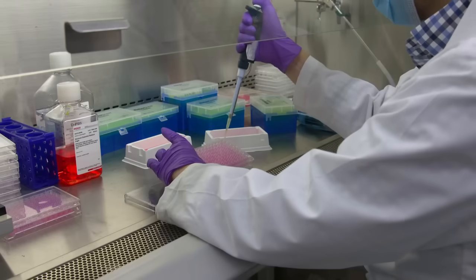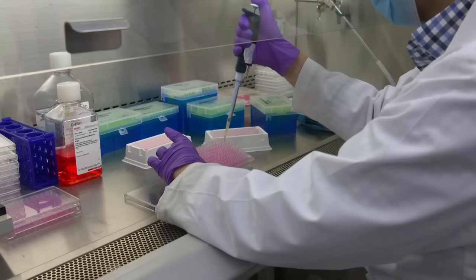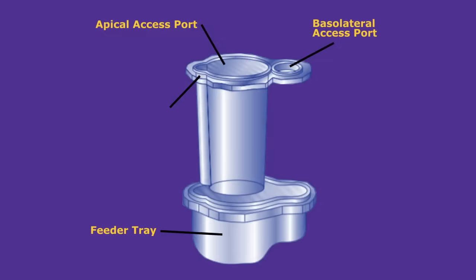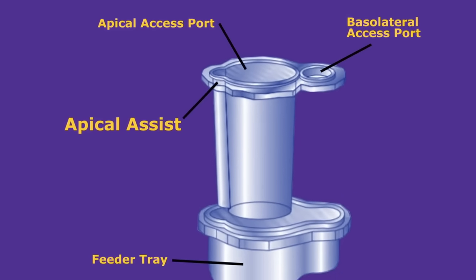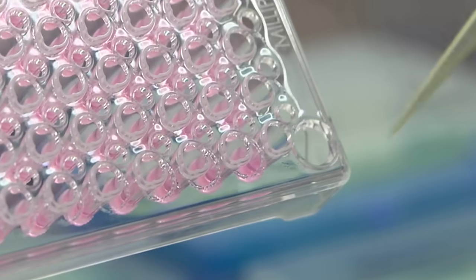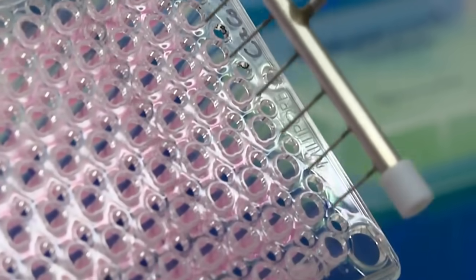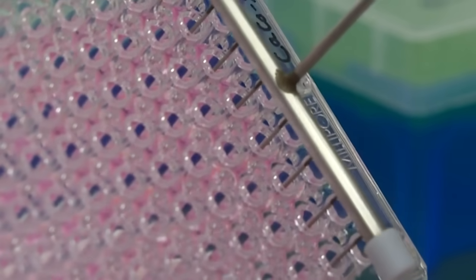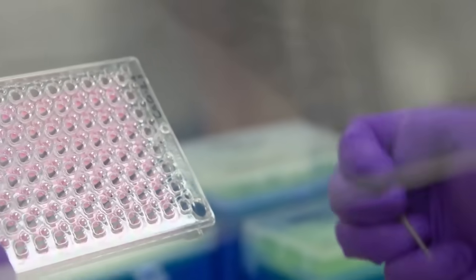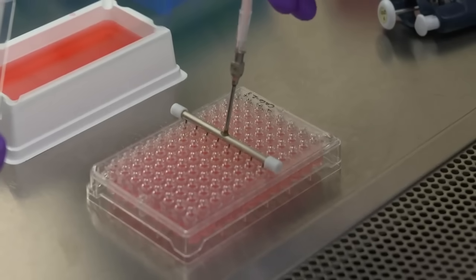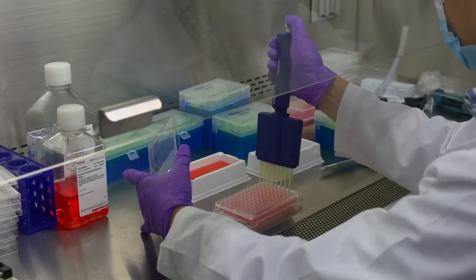Now let's go over how we can remove media from the apical side without touching the cells or the membrane itself during media exchange. Millicell culture plates have a patented feature called Apical Assist, which introduces a small membrane-free area to the bottom side of the membrane well. By directing my pipette tip or manifold into that area using the guide feature, I can ensure that cells growing on top of the membrane will not be disturbed during apical media exchange. This will also prevent any accidental membrane puncture or scratching during media exchange.